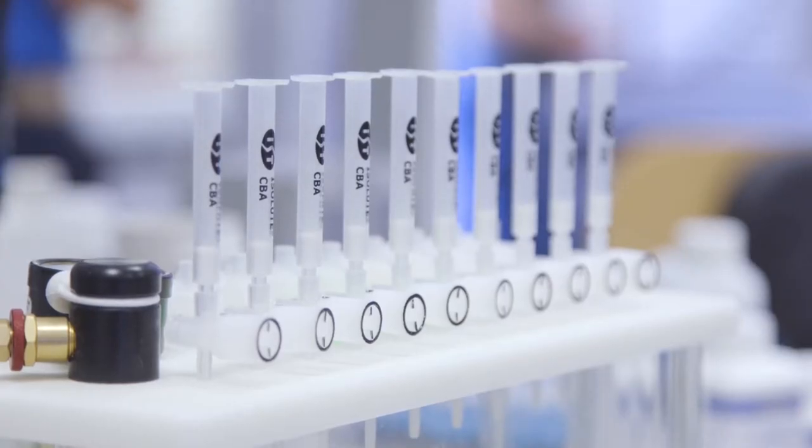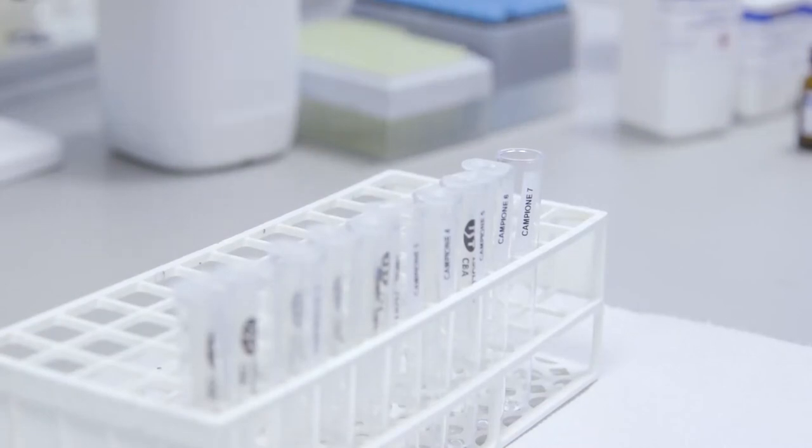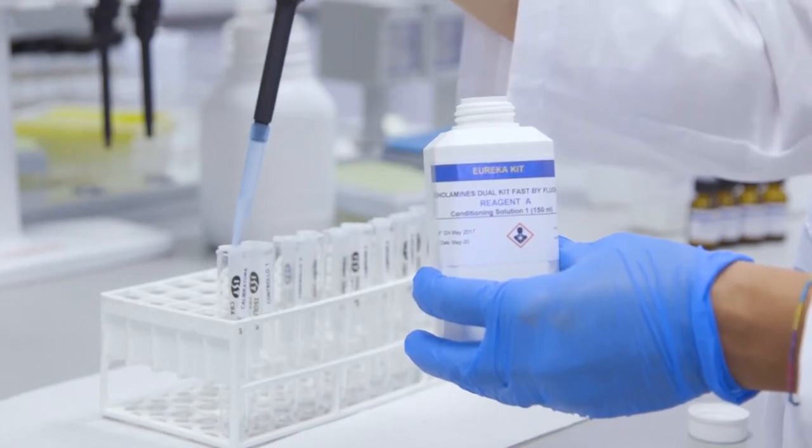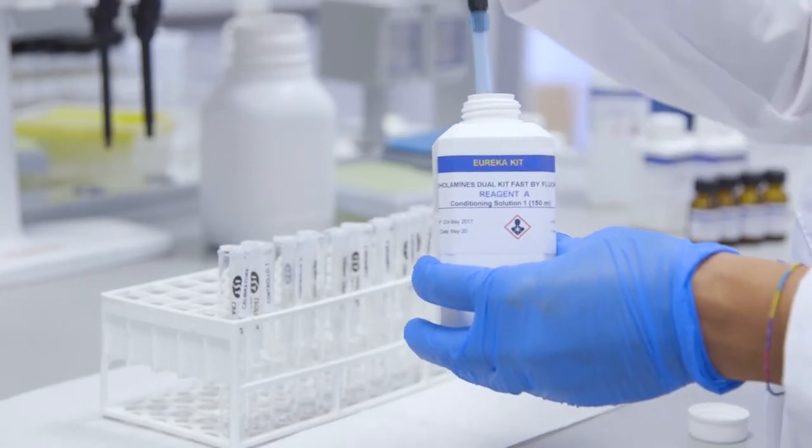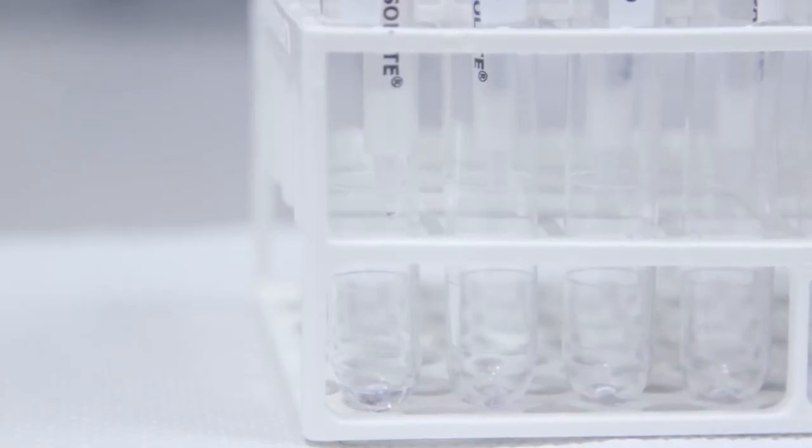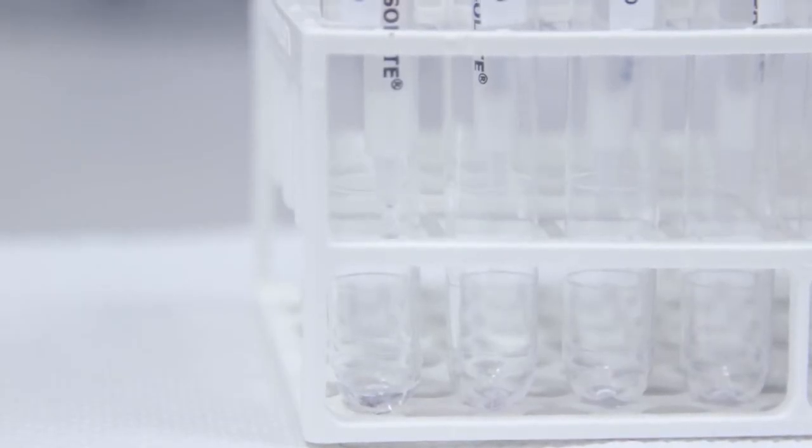We place the SPE column in the plastic tubes in order to collect the eluate to be discarded. Activate the SPE column by pouring into the column one milliliter of reagent A conditioning solution one and let it percolate through the column at a flow of one milliliter per minute drop by drop.